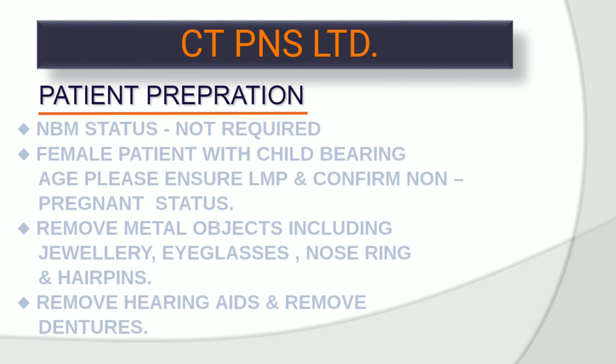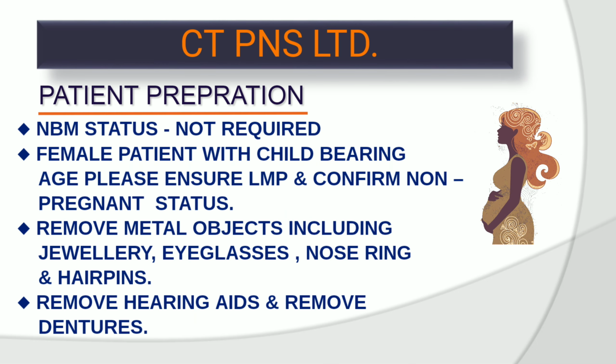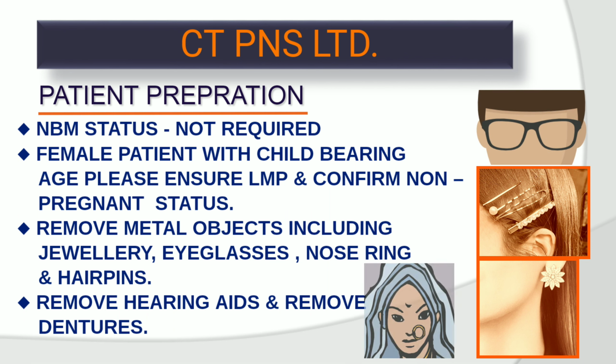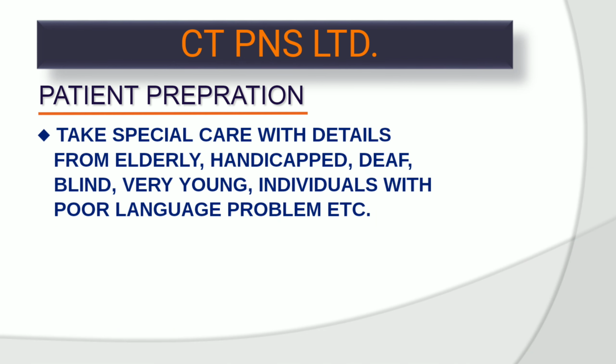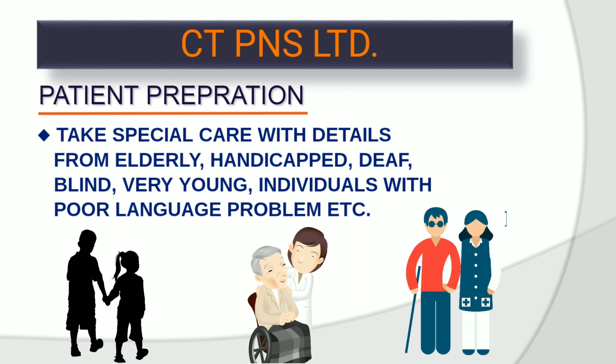Patient preparation: NBM status not required. For female patients of childbearing age, please ensure LMP and confirm non-pregnant status. Remove metal objects including jewelry, eyeglasses, nose ring and hairpins. Remove hearing aids and dentures. Take special care with details for elderly, handicapped, deaf, blind, very young, individuals with poor language problems, etc.